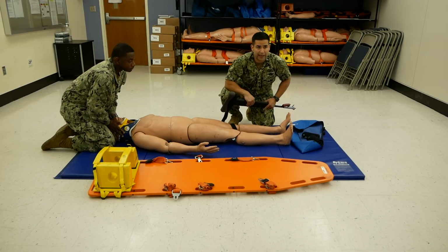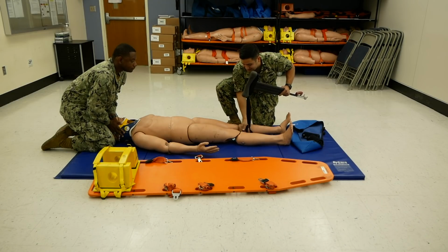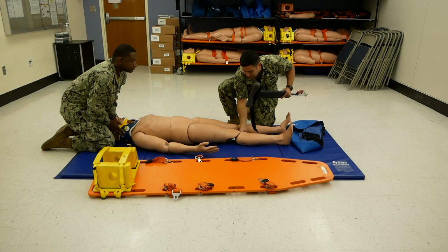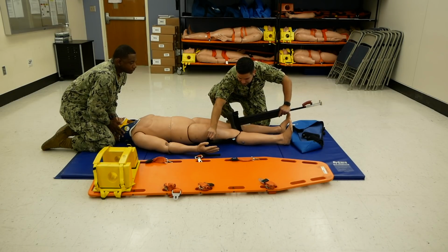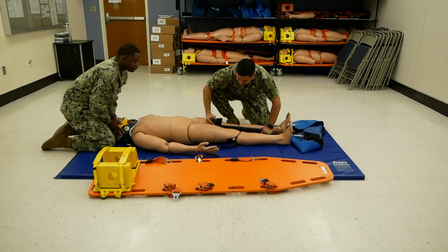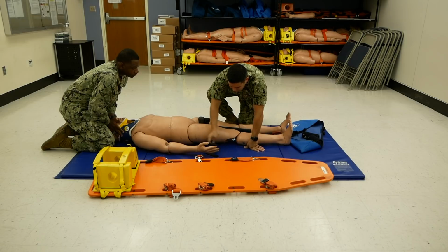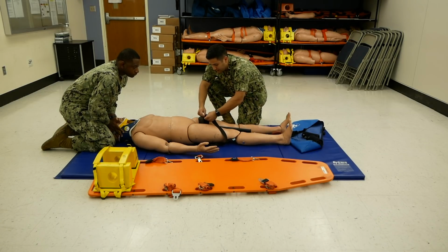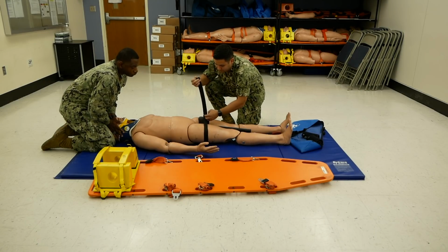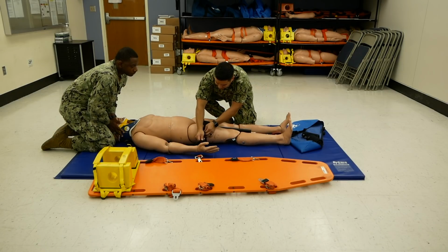Now you go ahead and position the Sager splint. In your lab sheet, it tells you to go ahead and slide it to the ischial tuberosity of the patient. What that is, is just sliding the traction splint as high as it can go. Go ahead and slide it up. And then you want to secure the traction splint at the top of the affected limb. Go through 2 D-rings and then back through 1 and secure tightly.